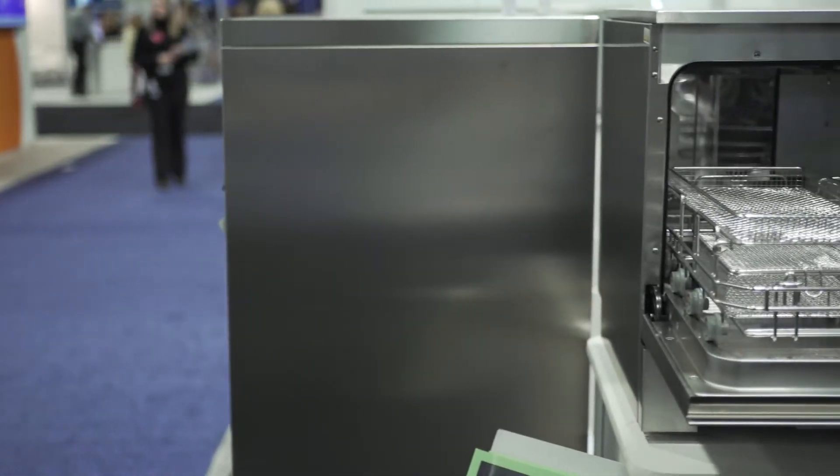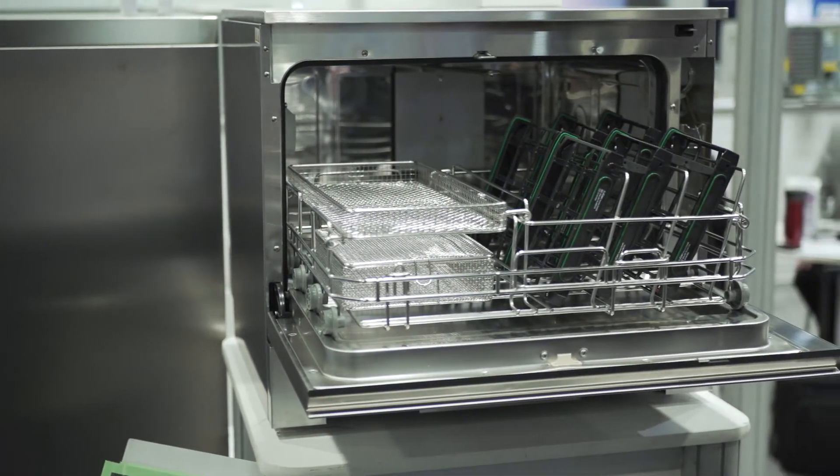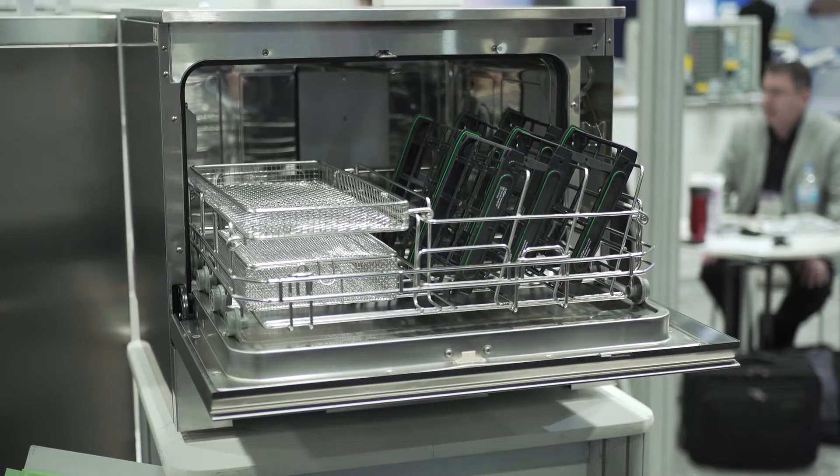If you think of it this way: if an instrument came in with a million bacteria on it, once it goes through the proper cleaning process, there are less than six bacteria left. Then the sterilizer's job is just to kill those last six.